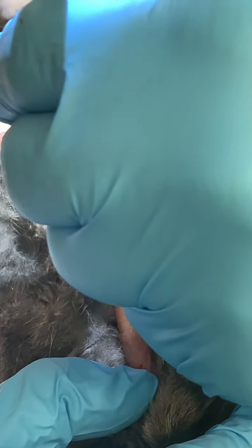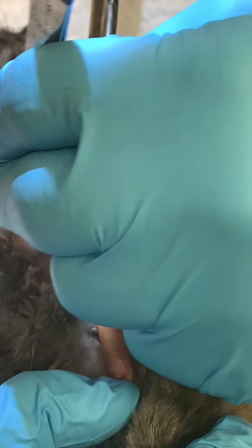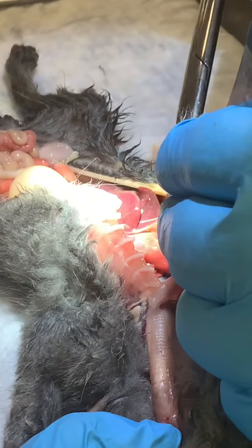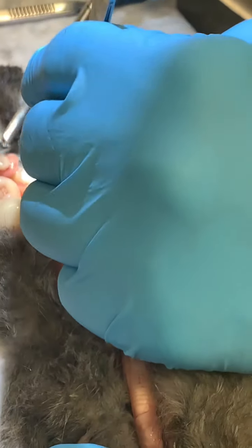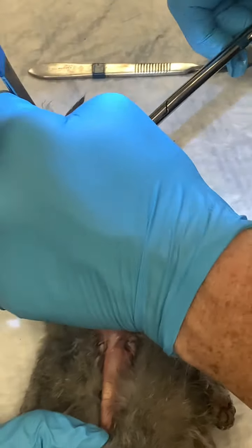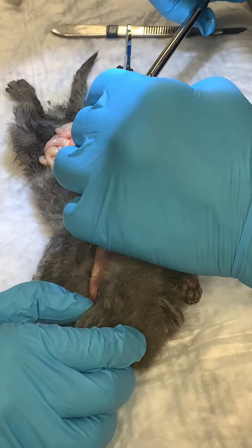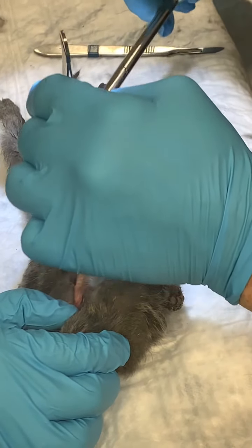I thought we had some lung pathology and some atelectasis of the lungs, but this doesn't look so bad. He did have what looks like an enteritis inflammation. The kidneys, without opening them, look pretty good, and the spleen looks good.